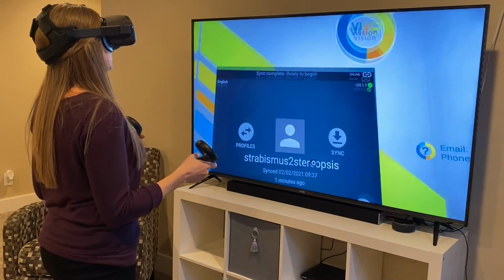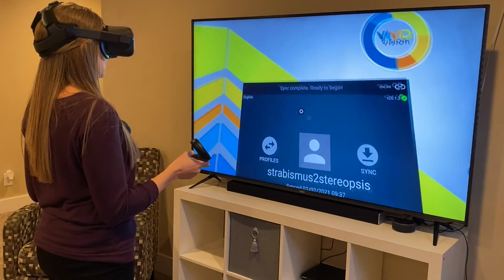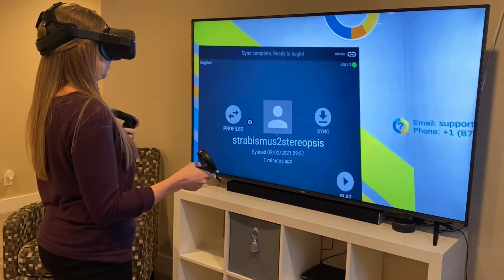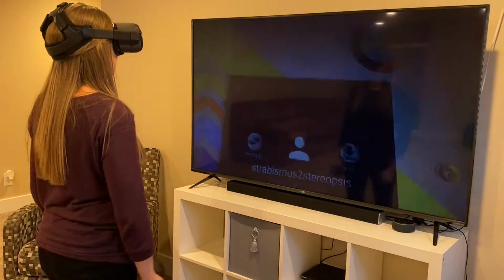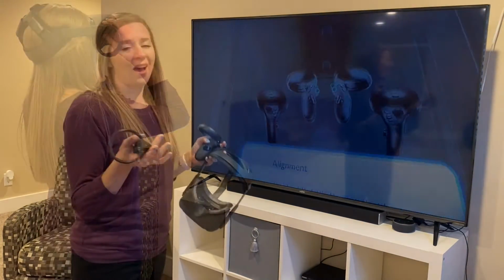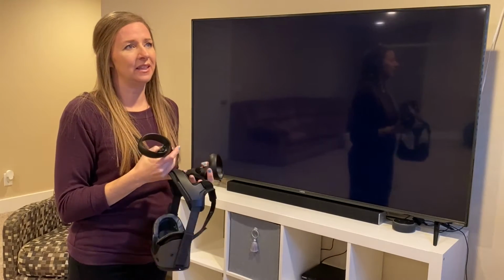Okay, so this is the main menu. I've got my Strabismus to Stereopsis account going. I can sync it at any time, and it sends all of my information to my optometrist. But all I do is I come in and hit the play button and see what he has for me.